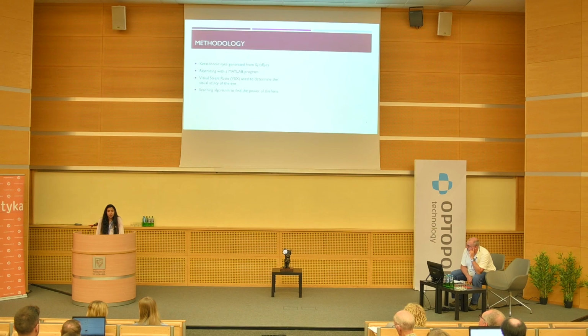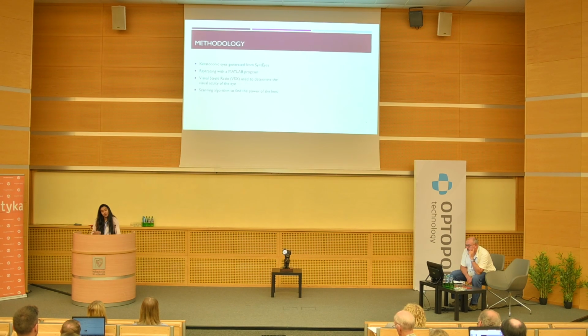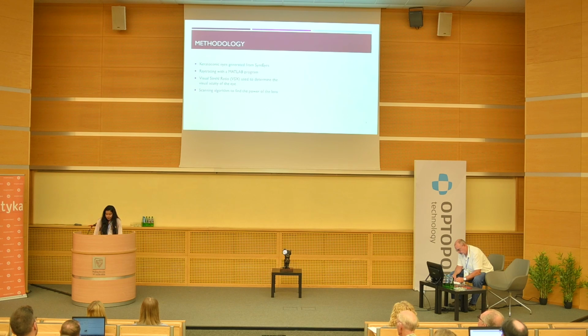So we know in terms of IOL corrections, IOL power equations are used to find power, but here instead we are using a scanning algorithm that scans the spherocylindrical space through multiple steps until the resulting lens could give a maximum of VSX. The same algorithm is used to find the correction, whether it's a contact lens or IOL used.